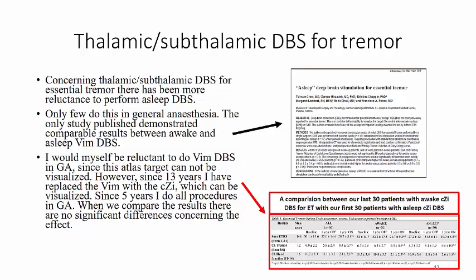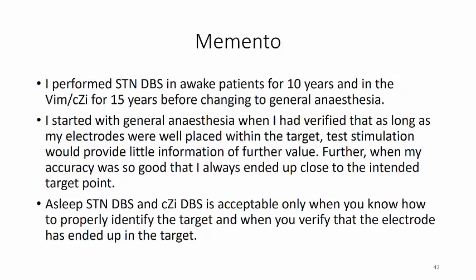However, for 13 years I have replaced the VIM with the so-called zona incerta, which can be visualized, and for 5 years I have done all procedures in general anesthesia. When we compare the results, there is no significant difference concerning the effect between asleep and awake surgery. But a word of caution.